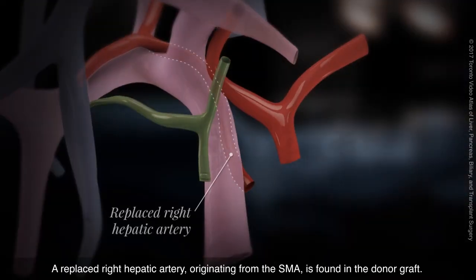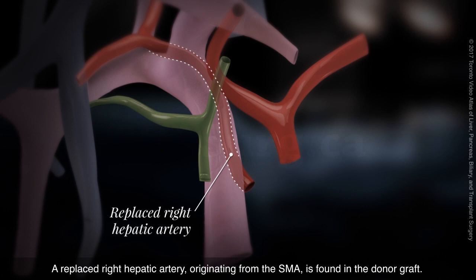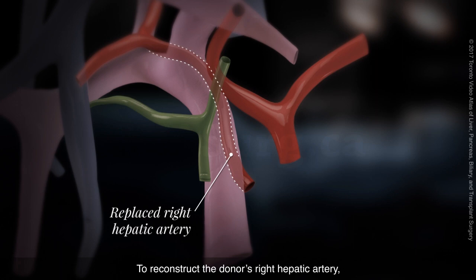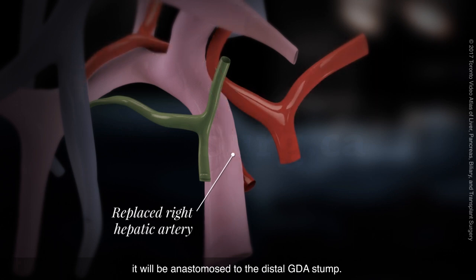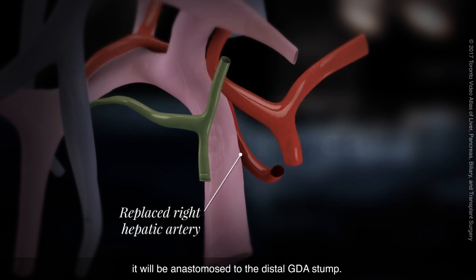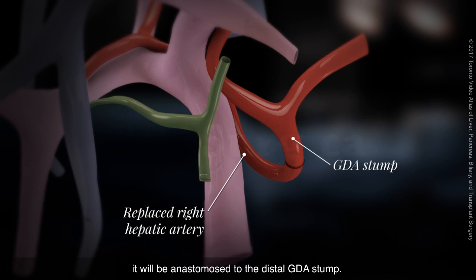A replaced right hepatic artery, originating from the SMA, is found in the donor graft. To reconstruct the donor's right hepatic artery, it will be anastomosed to the distal GDA stump.